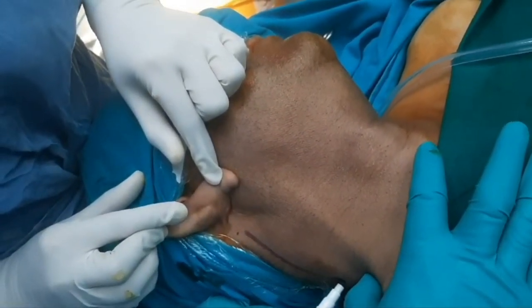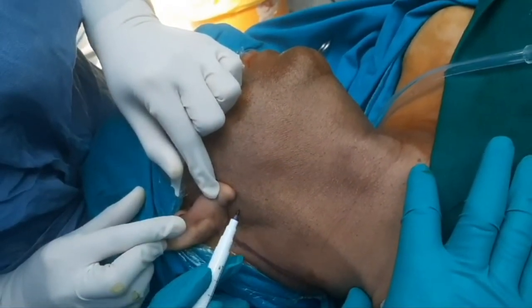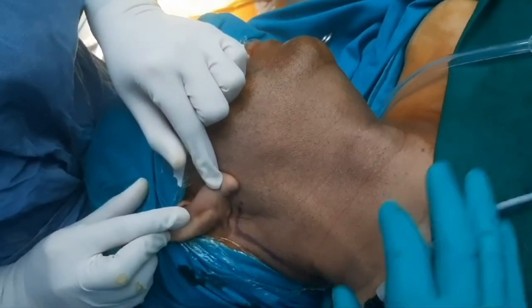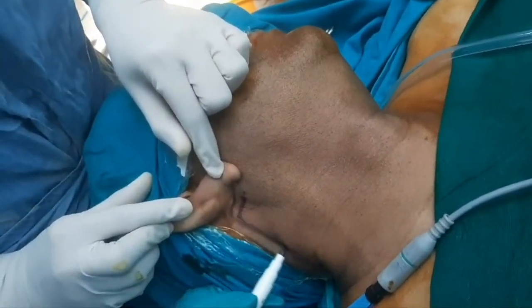Let's mark the incision first. We will place our incision in retroauricular area. It has got one big limb and a small limb, right? Patient is in supine position with chin rotated to the opposite side.